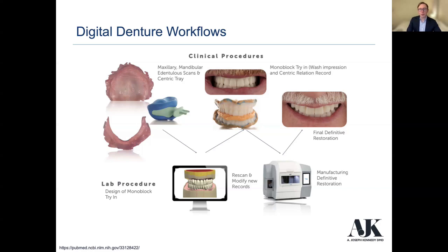You get your bite and centric relation, send that back to the lab, or you can scan it in your office. And if things are looking good there, then you just go ahead and send that to the milling unit or the printing unit. And so that's the technique here.